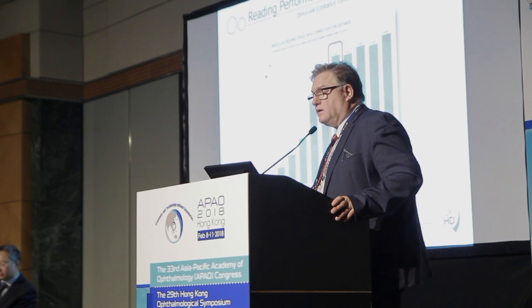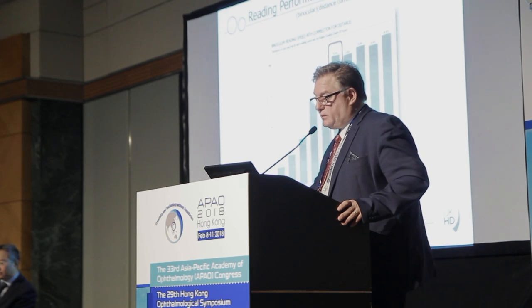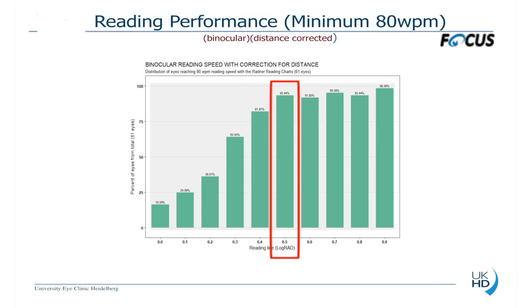When we look at the binocular reading speed in our patients, and if we say we need 0.5 logRad and a minimum of 80 words per minute, we can see that 93 to 94% of these patients already achieve that.